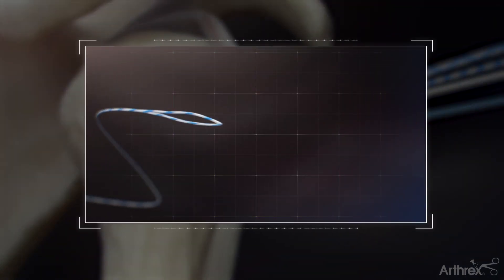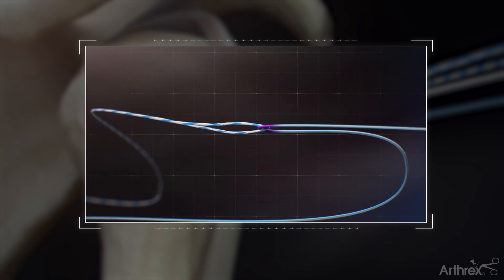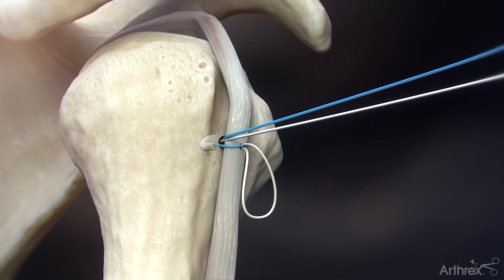Load the blue fiber wire repair suture through the shuttling suture loop and fold the repair suture limb at the purple indicator mark. Pull the tape end of the shuttling suture to shuttle the repair suture through the knotless mechanism and tension the repair suture around the biceps tendon.